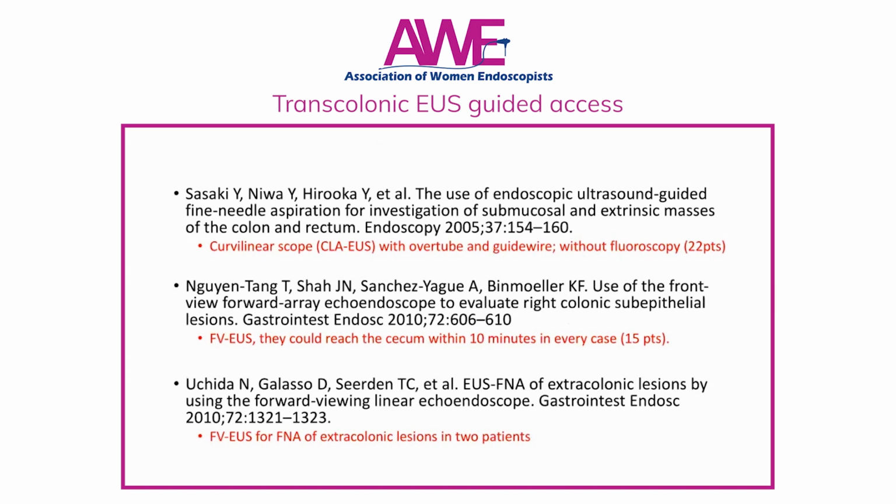So transcolonic, there have been a few reports and case series. So back in 2005, Sasaki described in 22 patients, they used the curvilinear scope with an overtube and a guide wire, and they were able to evaluate submucosal and extrinsic masses of the colon and rectum.